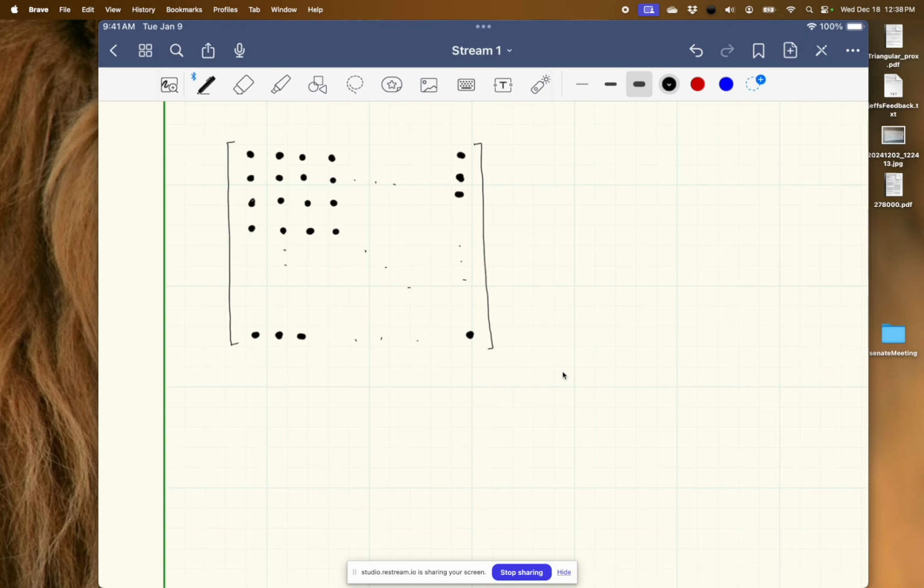if you have multiple coils, each of these solid points represents a spatial frequency, a k-space location, that is collected by all coils. So each of these points represents a vector of C. Right? What if we don't collect some of these points?